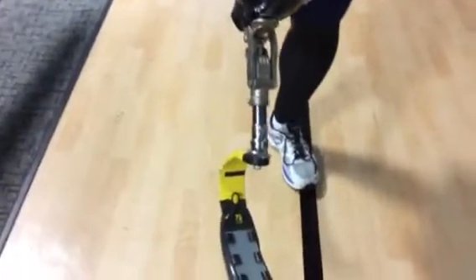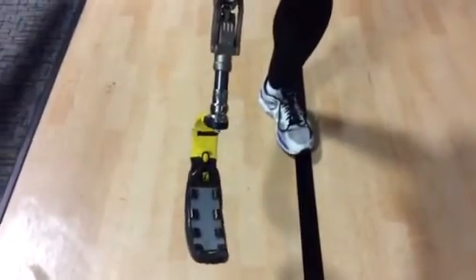Now I'm using a cheetah foot, which is attached to a meta knee, which has a bend. And if you run with a circumduct method, you are going to want to use a stiff leg. Some people don't even use a hinge with their knee to do that and just have a straight leg, especially if you're bilateral, but you can also do it if you only have one. So I'm going to show that one and then the bent knee method.